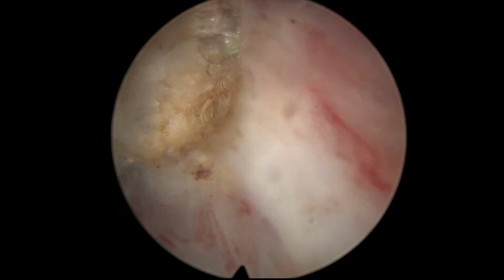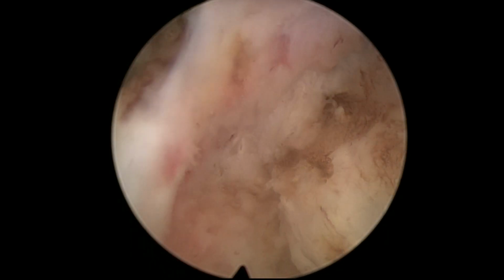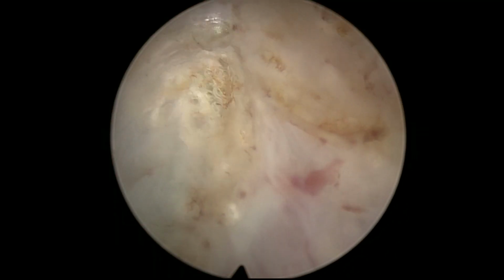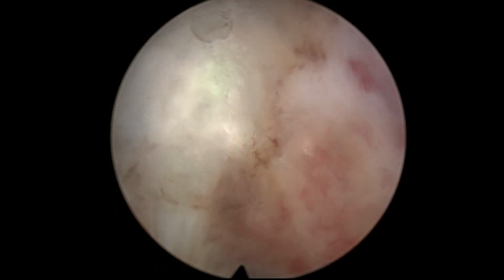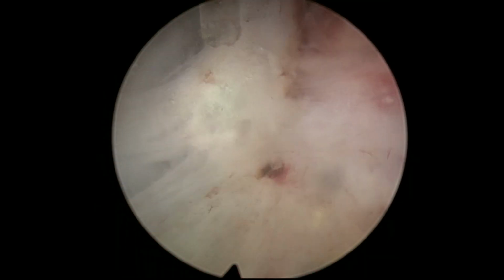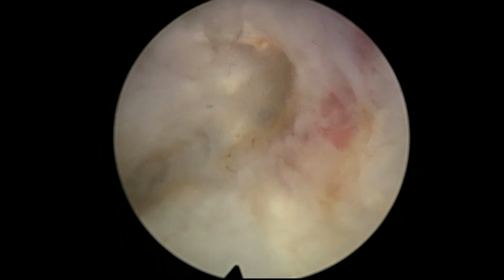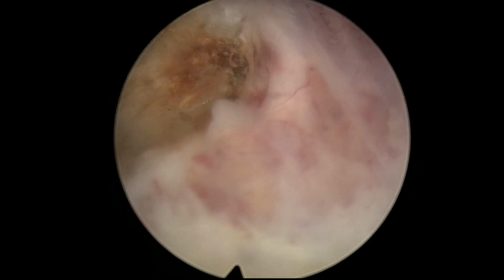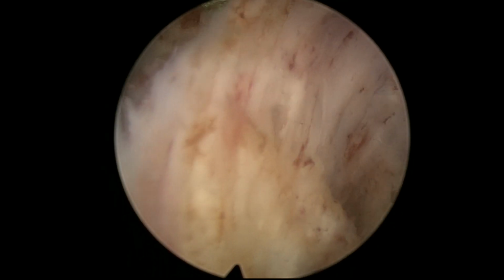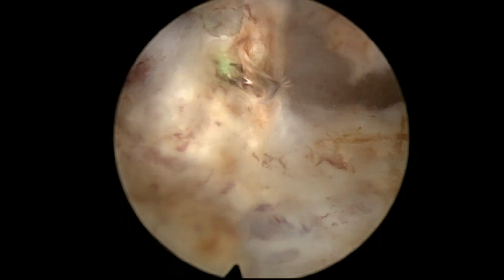So as you can see, I'm replicating the classic en bloc enucleation with early apical release. I have been able to dissect the apex of the prostate away from the capsule in the lower part and on the left side of the patient. And now I am following the usual steps to go up on the right side of the patient and trying to connect anteriorly. So you can see that once I have dissected a little bit of the anterior part on both sides, it's very easy to recognize what remains in the middle at 12 o'clock.